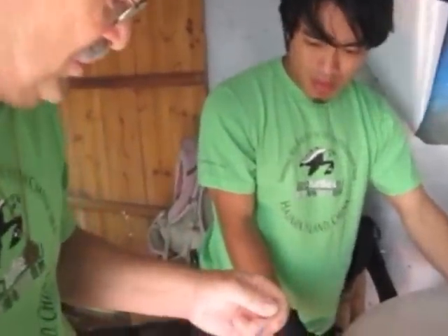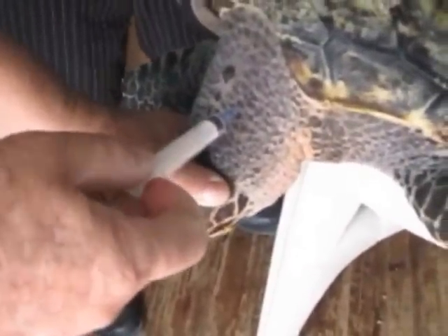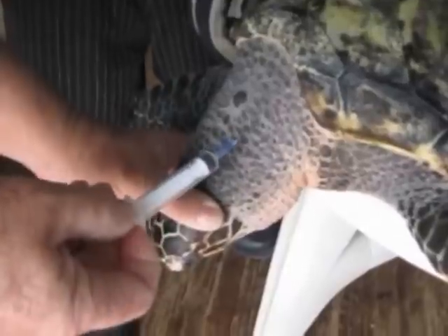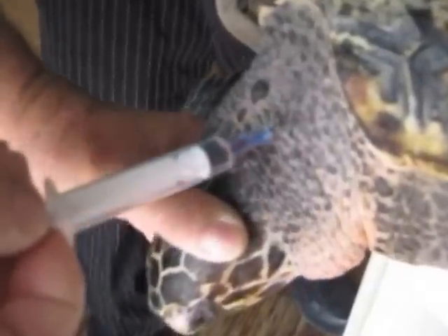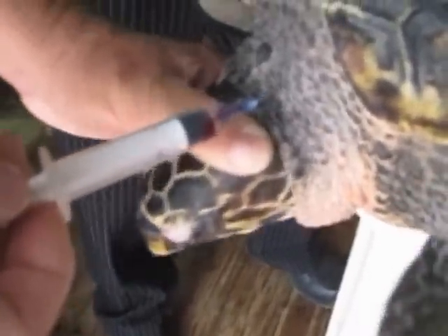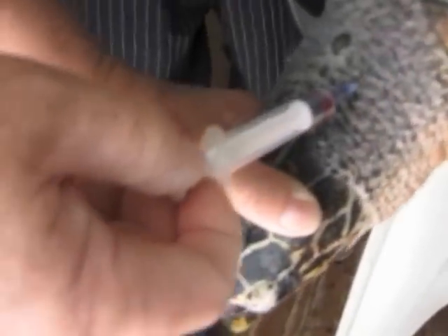Let's just take a chance here and see. We're going to tilt the turtle up this way. Going in — usually there's almost no pain to the turtle. The needle is in, so now I'm going to start doing some suction. See, if I let go, it pops right back because there's no blood in there yet. Oh my God, it came really easy — but wait, hang on, he kind of moves the spot on me.